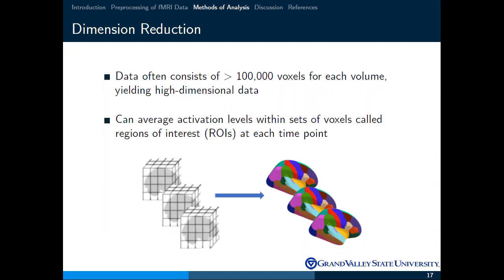And then are things kind of close to where they're supposed to be located or kind of far? How do they measure whether something is near a region, so to speak? Right. So I guess this averaging is done after registering or projecting onto that same space to try and minimize how much it's off, but you're right that it is still a problem that you might have some of the parietal lobe outside of the parietal lobe ROI, and that's a known problem or limitation. Yeah, definitely.